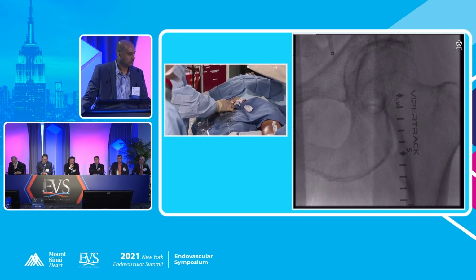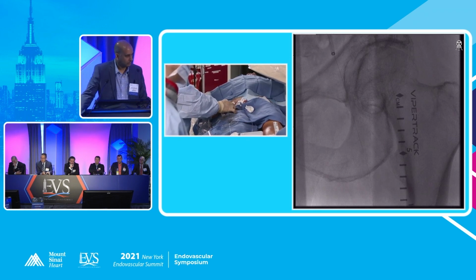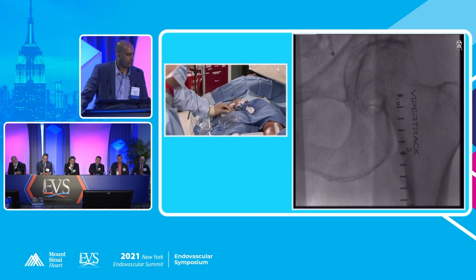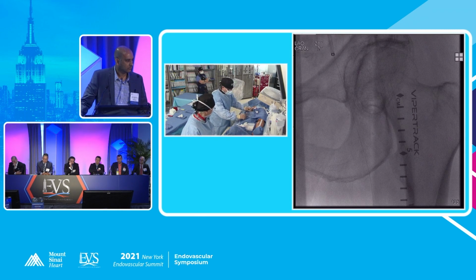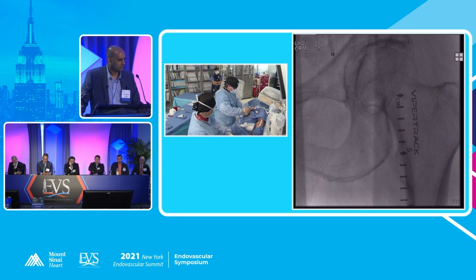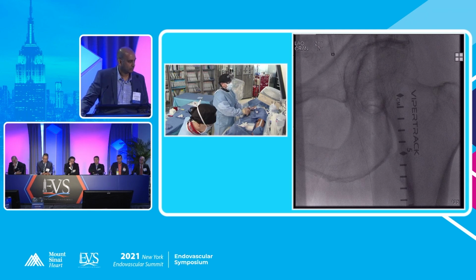Common femoral endarterectomy. Is it still the gold standard? And look, it's a great treatment in the right hands. I think the wound infection rate is higher than people always think. Just take it out. All right, we'll just take the Shockwave. You're out of wire. In the NSQIP, it was 8% even in experienced hands at 30 days, and the mortality is 3.4%. Now, for a very calcified lesion, it is still good.